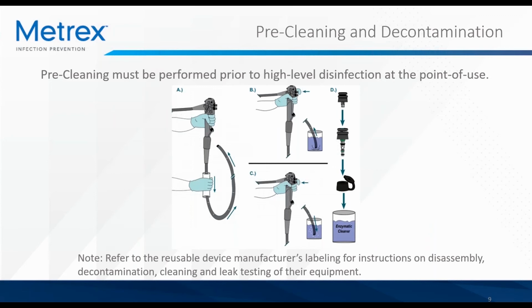Pre-cleaning is another important topic to discuss because pre-cleaning is necessary before any type of high-level disinfection. Improper pre-cleaning can actually hinder the disinfection process regardless of what high-level disinfectant solution you use. We at Metrex don't specify instructions for what your pre-cleaning process should look like because that will vary drastically based on the devices you're disinfecting. So it's important to refer to the reusable device manufacturer's labeling for instructions on disassembly, decontamination, cleaning, and leak testing of their equipment.